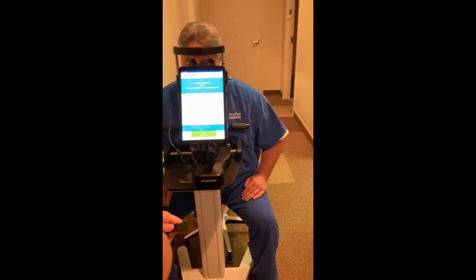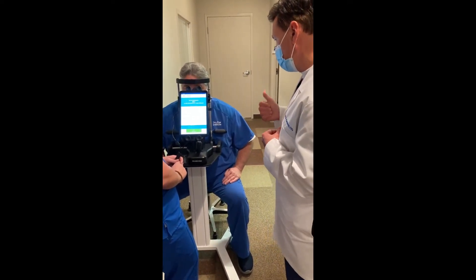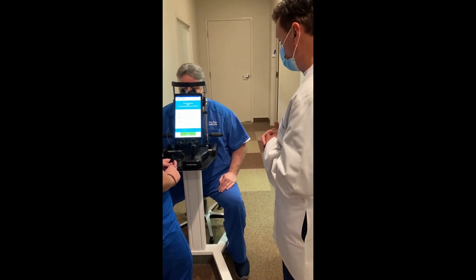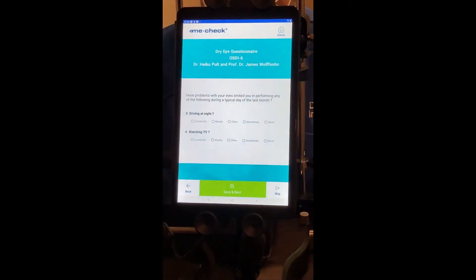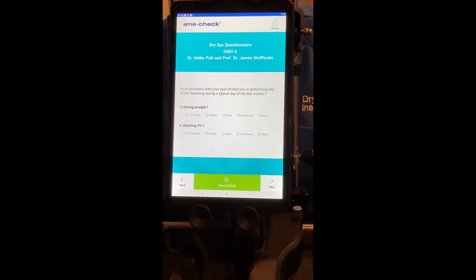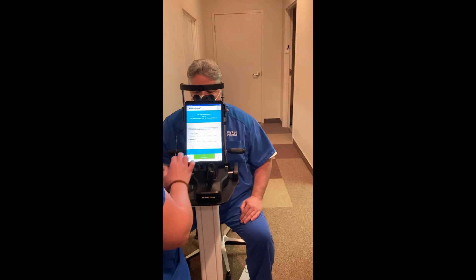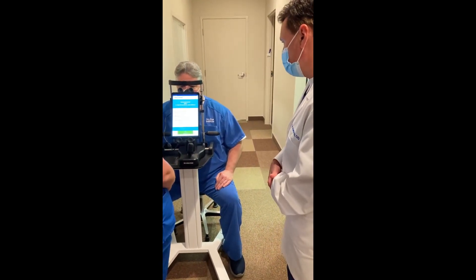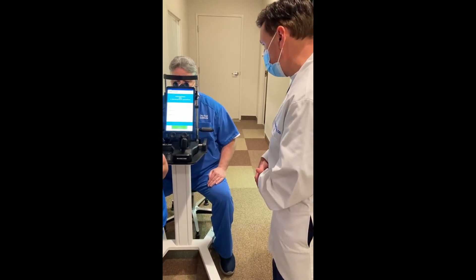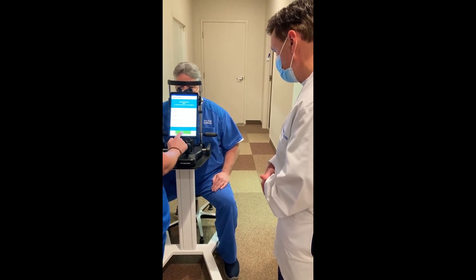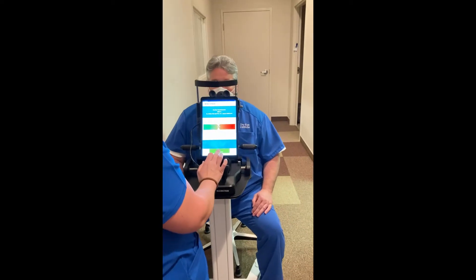This gives us the opportunity to now do the OSDI-6. I'm going to ask the patient: have you experienced any of the following during a typical day of the last month? Eyes that are sensitive to light — constantly, mostly, often, sometimes, or never? Blurred vision — constantly, mostly, often, sometimes, or never? Have problems with your eyes limited you in driving at night? Sometimes. Watching TV? Often. Have your eyes felt uncomfortable in windy conditions? Often. Places or areas with low humidity? Often. That was really it. It tells us that in terms of your symptoms, you're a level two in terms of dry eye severity based on the Pult and Professor James Wolffsohn scale.